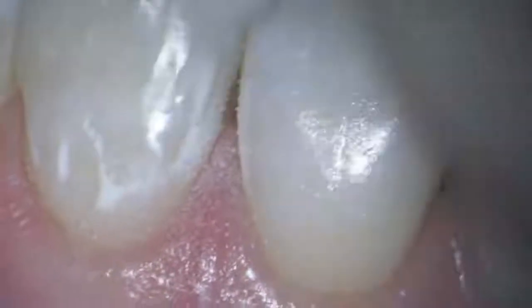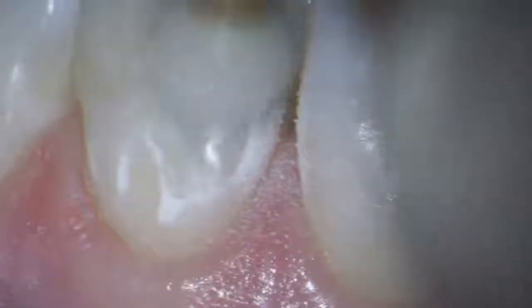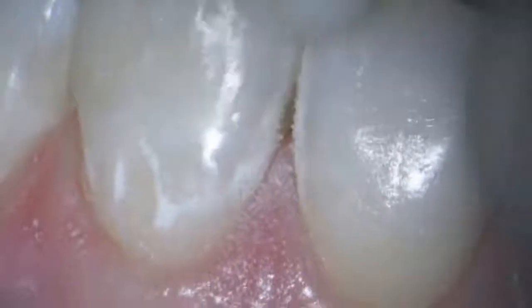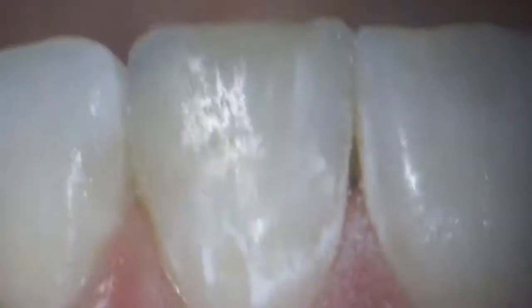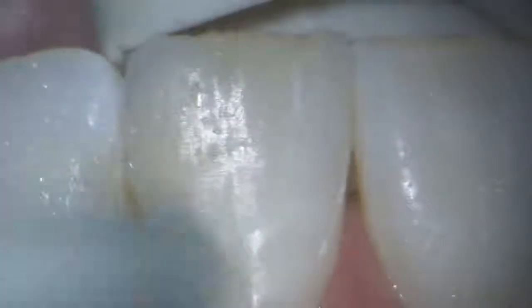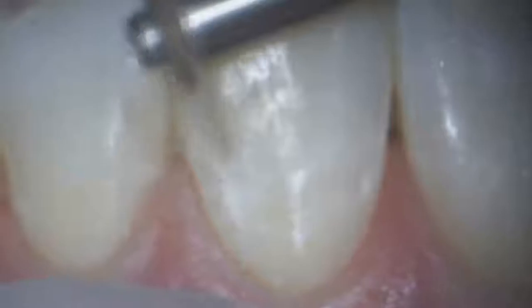So objections related to possible sensitivity and tooth overheating due to the lack of water cooling are absolutely unfounded. Such problems do not appear if we keep working at a low rotation speed. Usually I use from 10 to 15,000 rotations per minute without strong pressure and with interrupting movements.